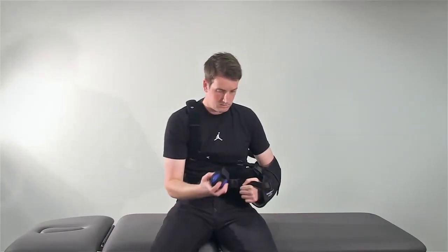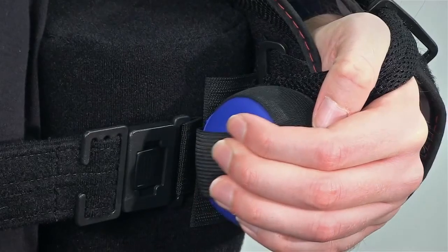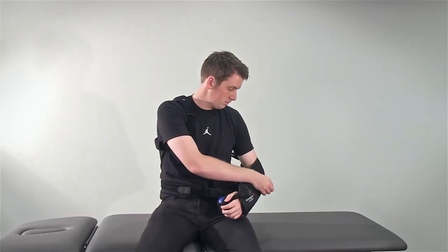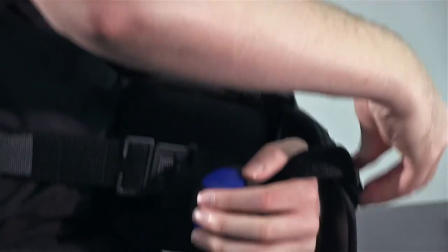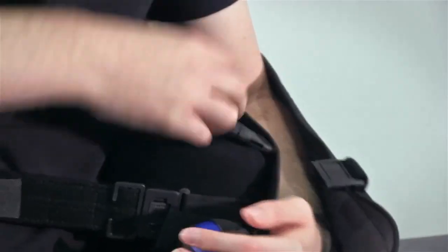The exercise ball can now be attached to the front of the sling. If you need to take your arm out of the sling to do exercises prescribed by your clinician, the forearm and thumb straps should be removed before detaching the outside quick-release buckle on the sling.